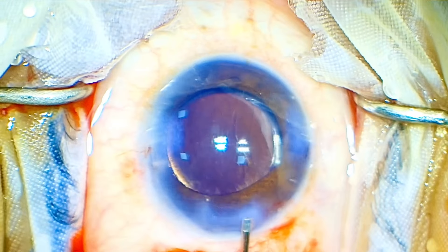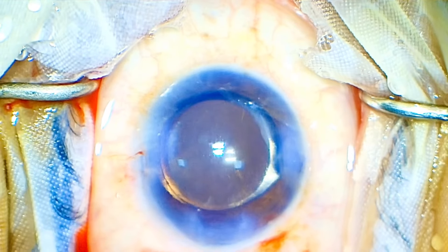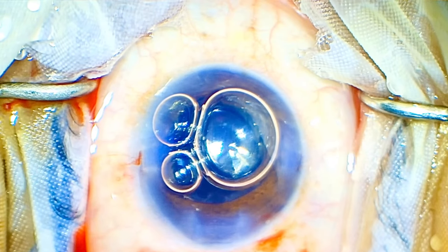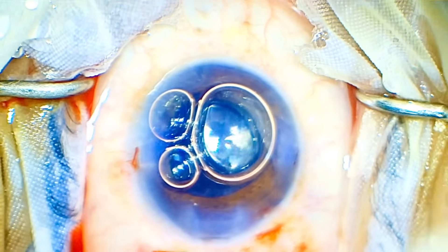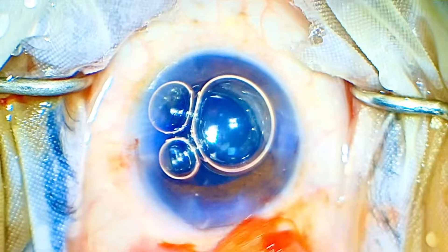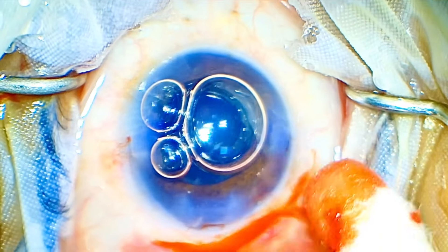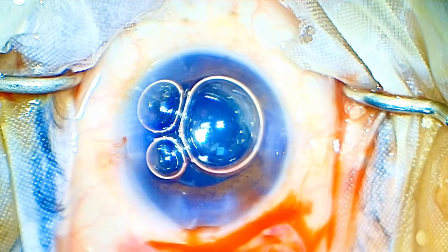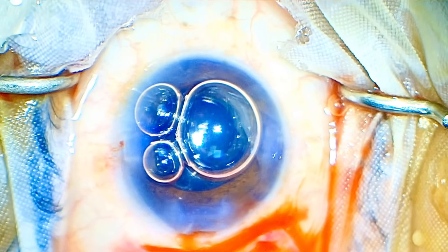I'll seal off the side ports and the main port just like a normal FACO and close this case. I do not do any suturing — the main tunnel was an inverted frown incision and astigmatically neutral, the anterior chamber was stable, and I did not feel the need for a suture. I am depositing the conjunctiva with a soft swab stick; as soon as we patch the eye it will stick on its own. No cautery, no suture — the conjunctiva reposited beautifully and the case is over.